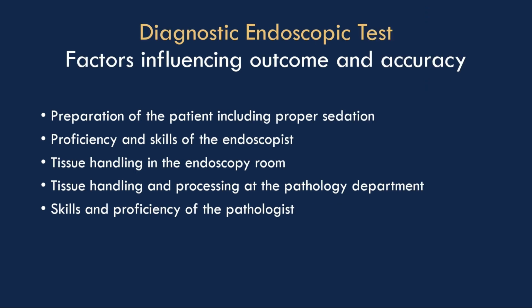This is very nice. You have a lot of diagnostic endoscopic tools, but you have to be cautious about the factors influencing outcome and accuracy of your test. You have to take care of the preparation of your patient when you do that kind of thing, including proper sedation. You have to have sufficient skills.